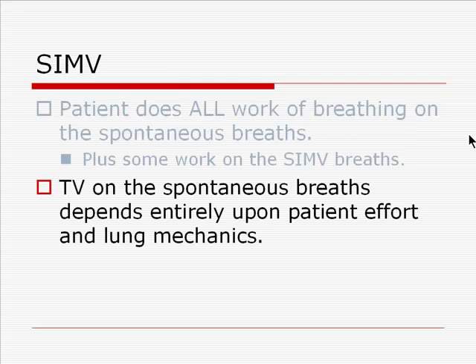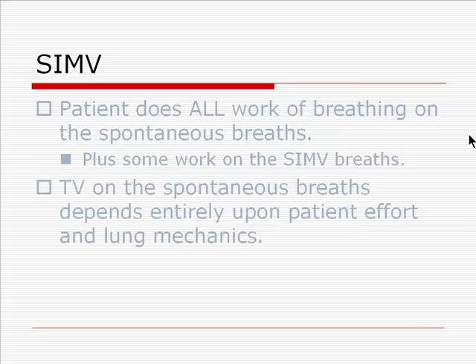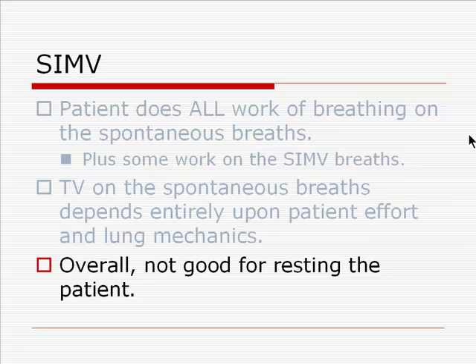The tidal volume of the spontaneous breaths depends entirely upon patient effort and lung mechanics. Overall, this is not generally a good mode for resting somebody, as if the patient triggers any additional breaths per minute, that extra work of breathing can, at least theoretically, result in respiratory muscle fatigue.